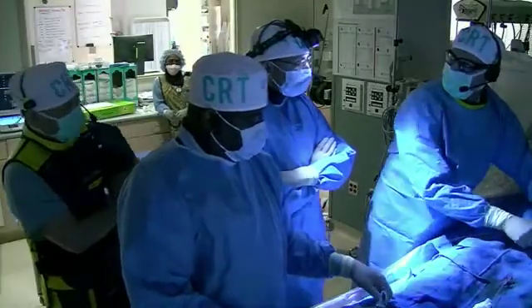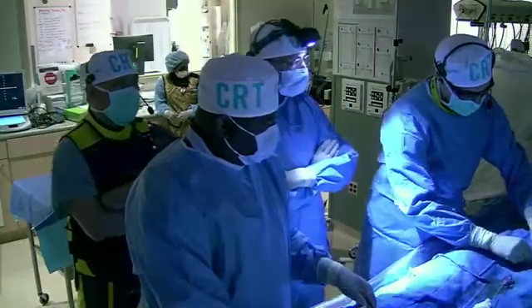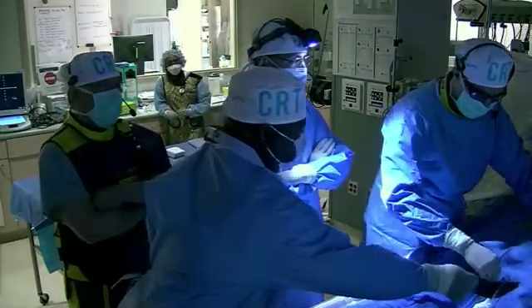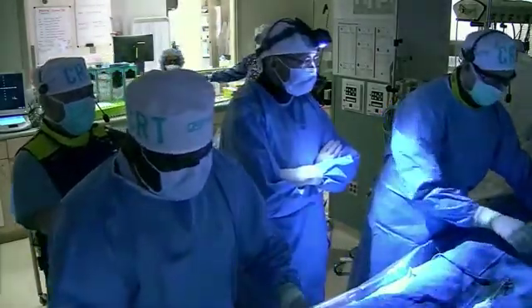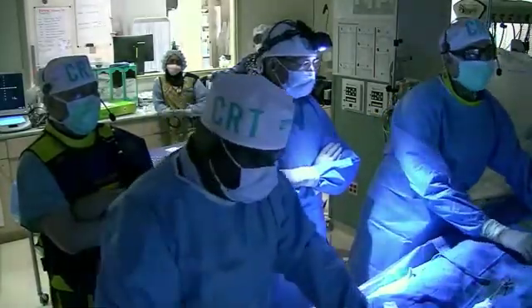I just need the 3.0 to deliver. My question right now: do you want to continue with that, or dilate first with the balloon and then follow again? Just take at least a 2.0 balloon down, as we did for the trial, and pre-dilate it nicely and then see what you get. And sometimes honestly, it's not worth all the time and effort. That's what I'm saying.